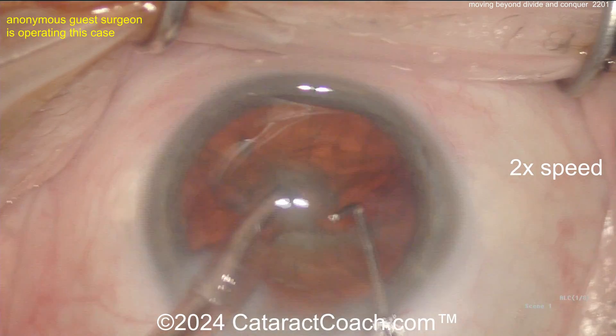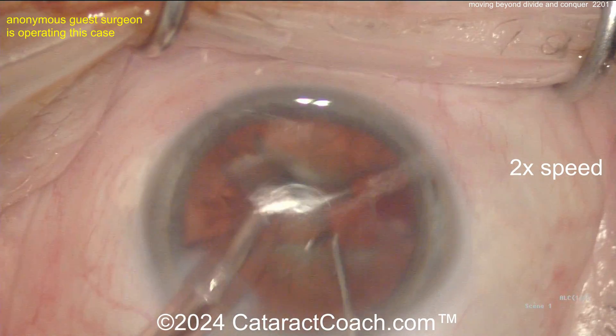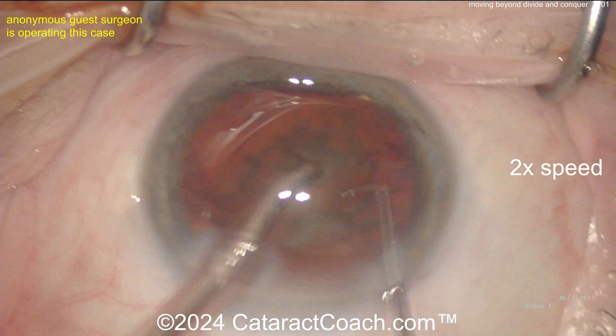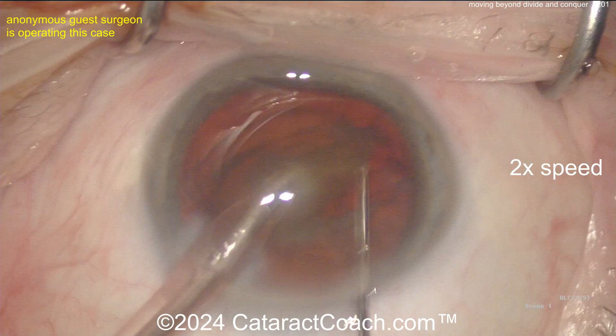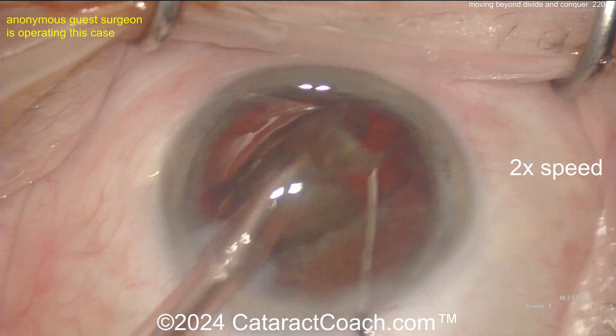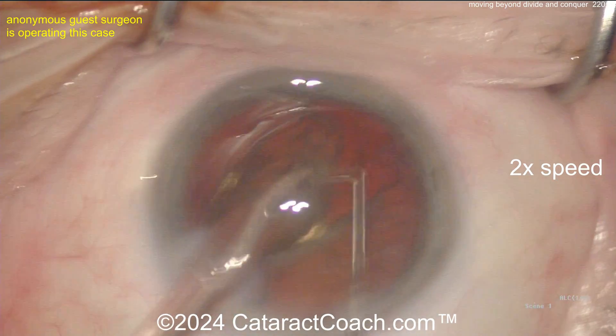Now let's do a better job of separating the pieces. We've got another kind of big mega-quadrant — buzz into it, and now with the phaco chopper go around the equator. You have a finite window to get the chop done, so really nothing happened there with the chops. Take this piece down — you still got a hemi-nucleus left.